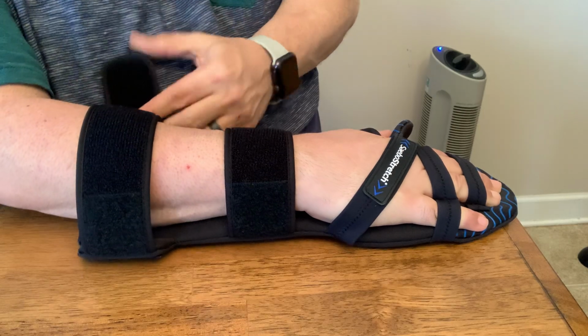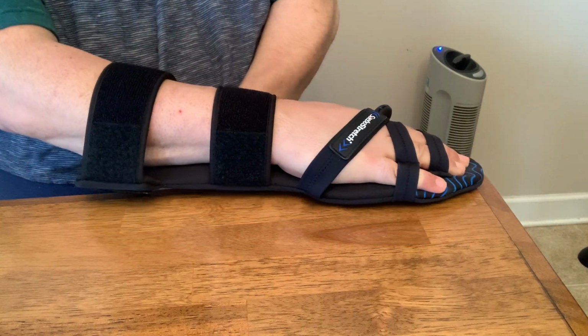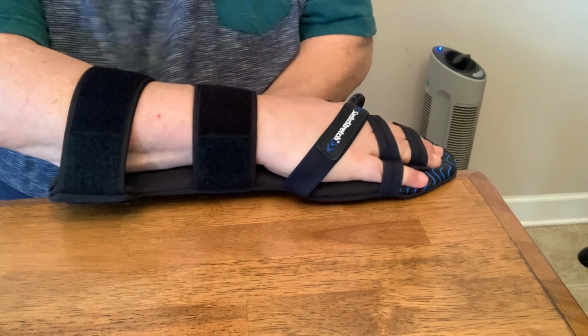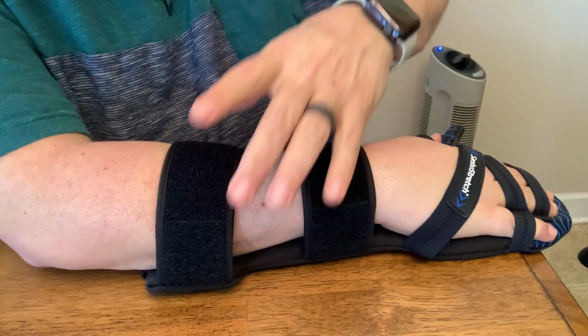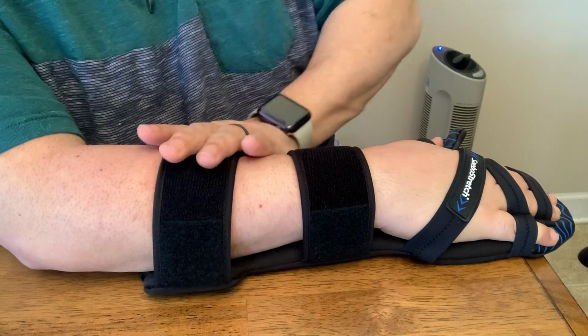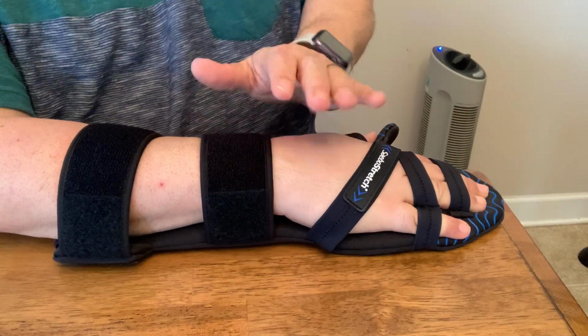Same thing with this one. Go to the edge of the table, a little bit hangs over, and you tuck under Velcro. Make sure they're firm. You can also bend if you want. I don't need to, but you can bend this to be comfortable around your arm. This strap works for me, so I don't have to change the shape of this glove.